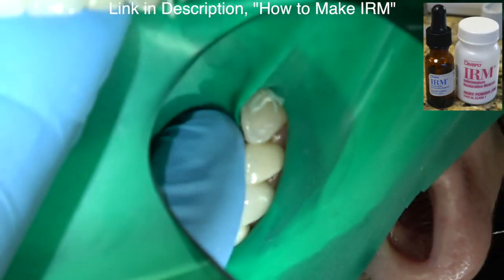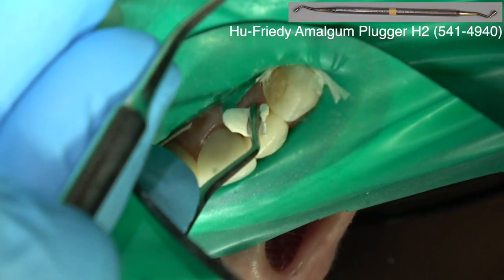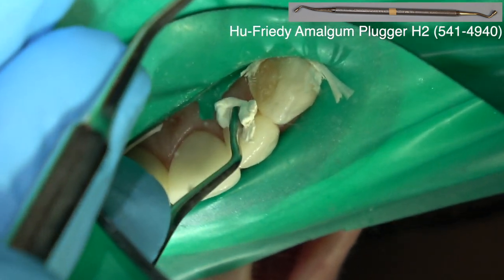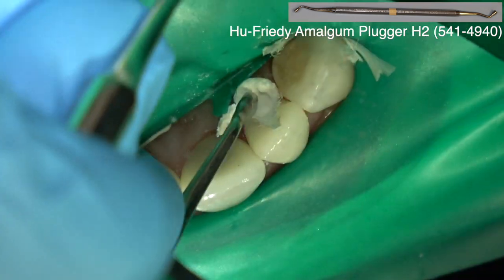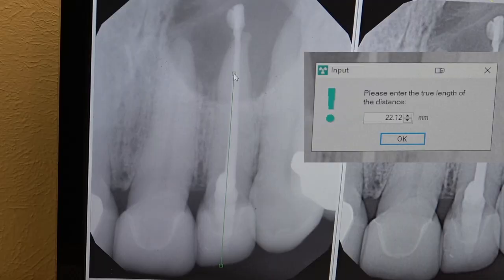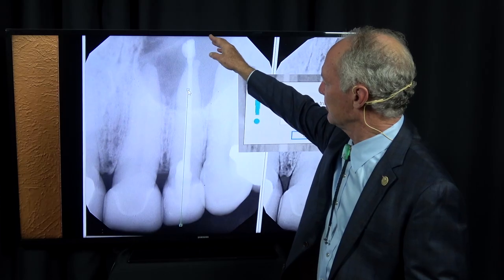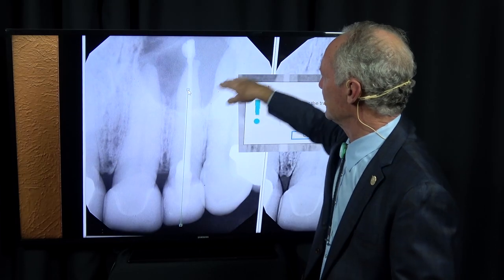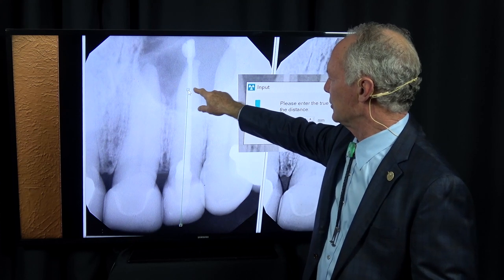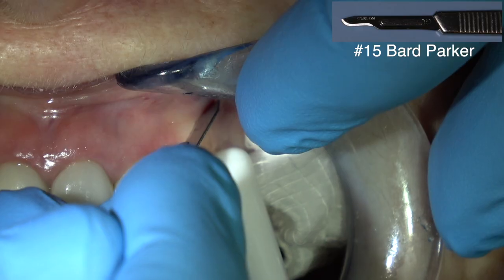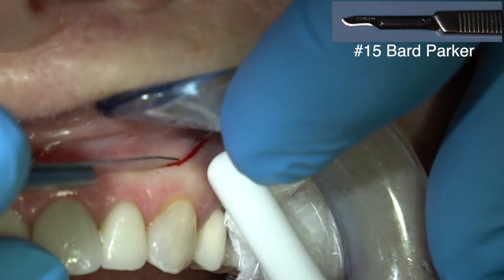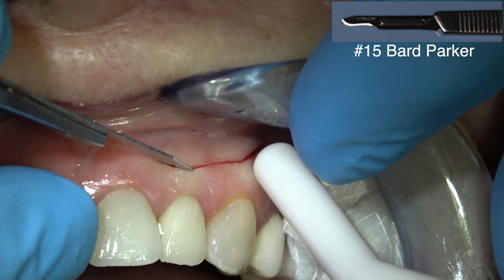I'm placing some IRM in the orifice, then we'll follow later once this is set completely with a highly filled composite. The gutta-percha is out the tip of the apex of the tooth into this giant granuloma. I'm going to cut the apical part of the tooth off right here and retrofill it — I don't worry at all about being past the apex of the tooth.